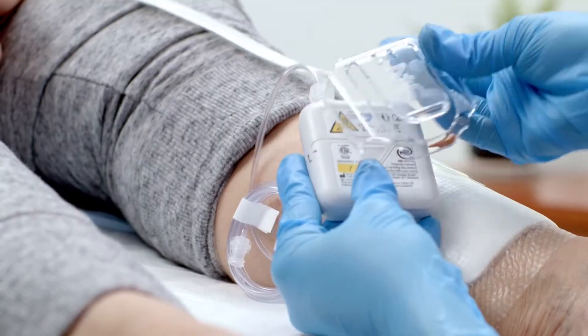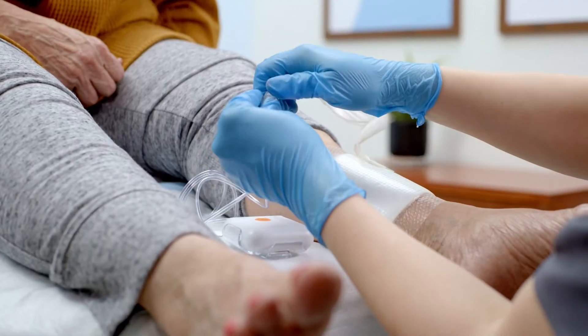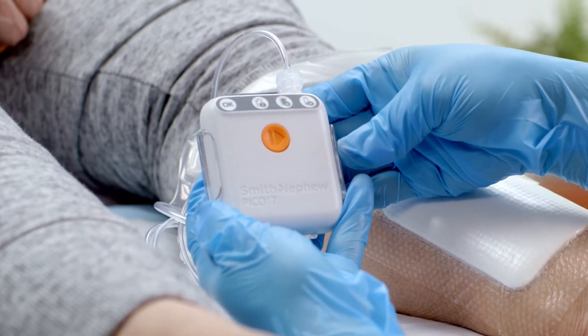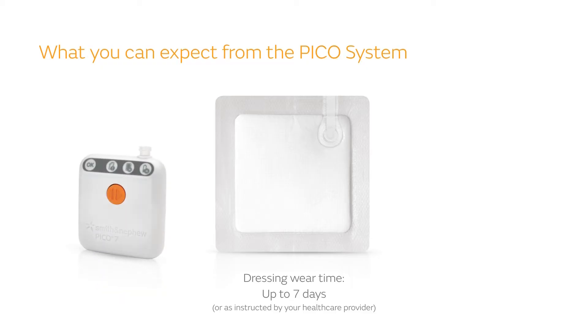The PICO system also comes with a belt clip to make it easier to take with you on the go. After the dressing is applied, you'll keep it in place for up to 7 days or as instructed by your health care provider. If you've been prescribed the PICO 7 system, the pump will shut off at 7 days.